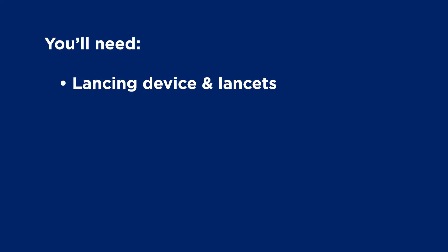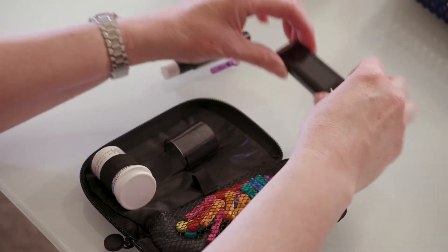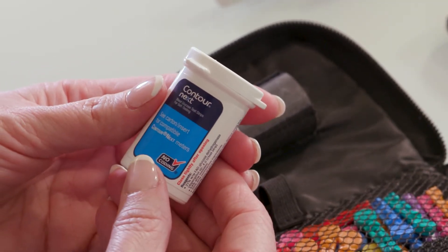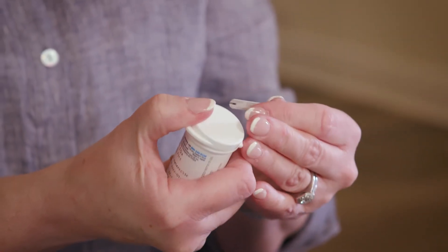You'll also need your blood glucose meter and test strips. You'll use these to test the drop of blood. Humidity from the air can damage the strips, so only take one out of the container when you're ready to check your blood sugar and always close the container tightly.